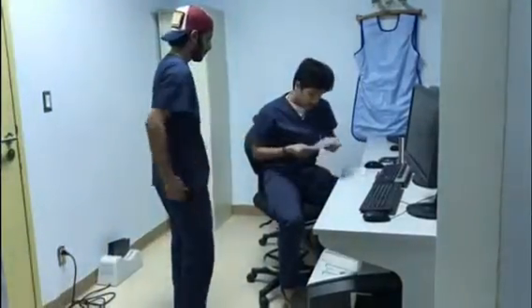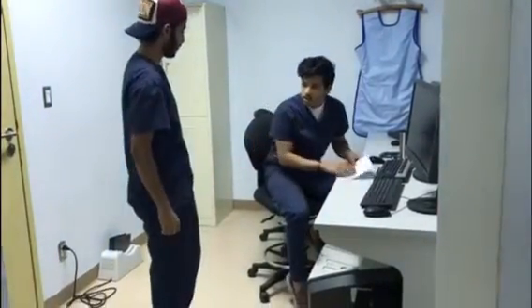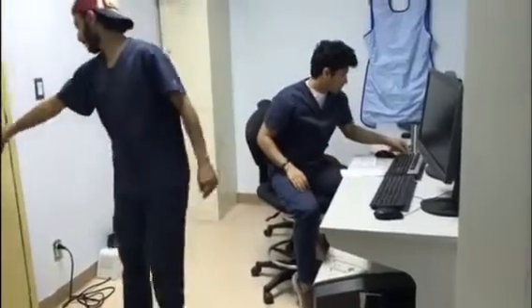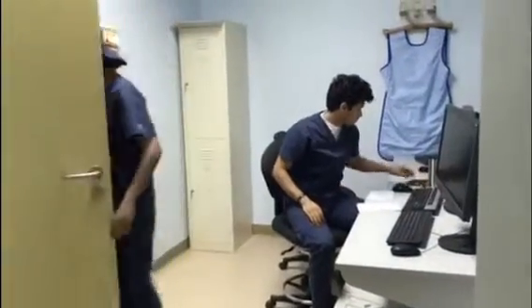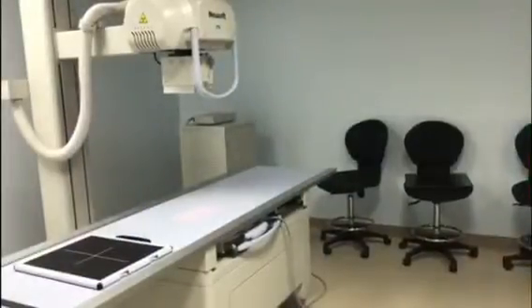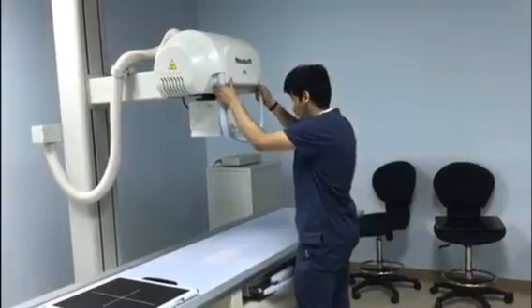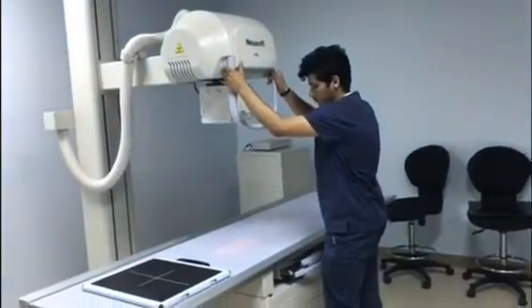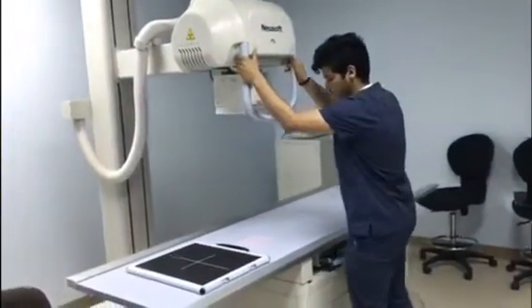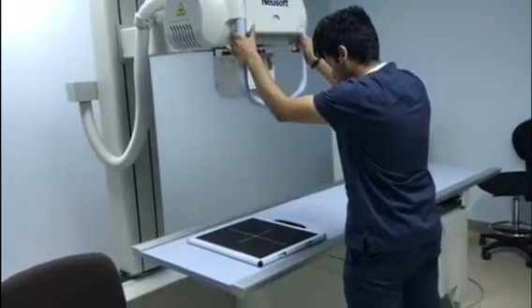The nurse gives the request with the positions written on it to the specialist. The specialist welcomes the patient for morality aspect, then sets up the X-ray unit by moving the X-ray tube horizontally to be perpendicular to the cassette or the IR.